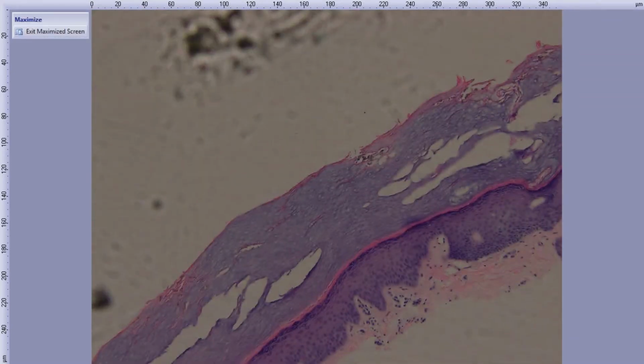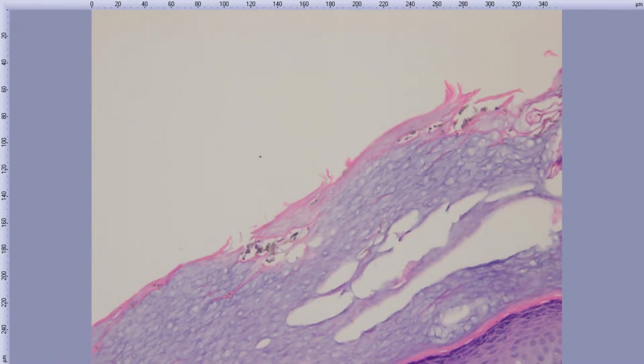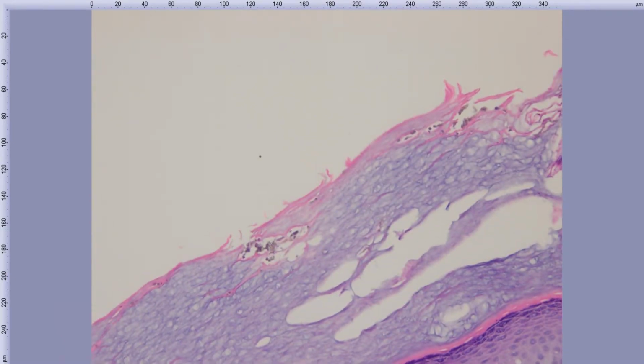And then I kind of zoomed you into the main area right here. What do you guys think about this one? Yeah, it was typed in as Tinea nigra.